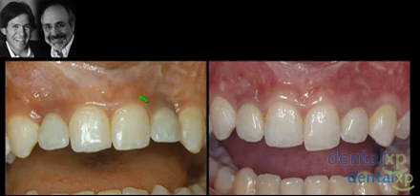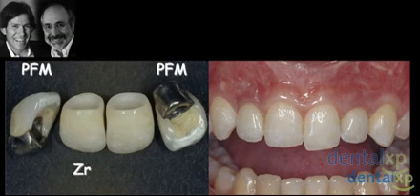Absolutely. I think the ability here to have, this patient was asked if any bone grafting or tissue grafting was done at the time of original implant placement, and the parents told us nothing. Nothing else was done, just the insertion of the implant. So obviously, a type 2 case treated as a type 1 case was the real mistake here. We had osseointegration, we had teeth in function, but just simply by adding the thickness of the ridge, whether it be with bone or soft tissue, added the aesthetics that was needed.